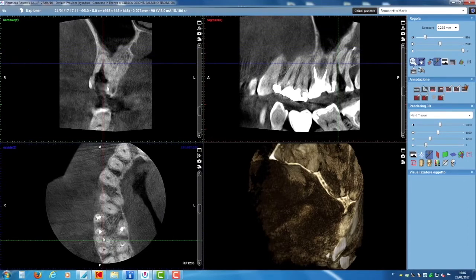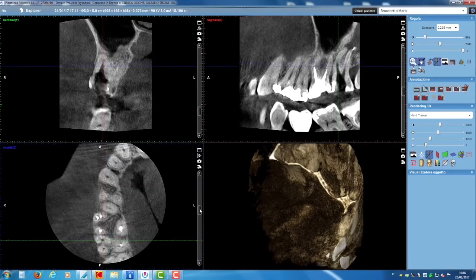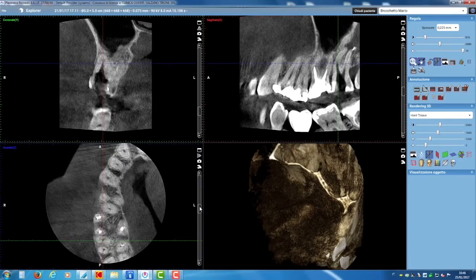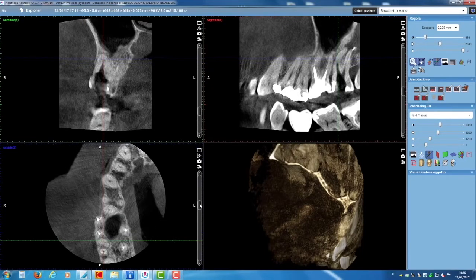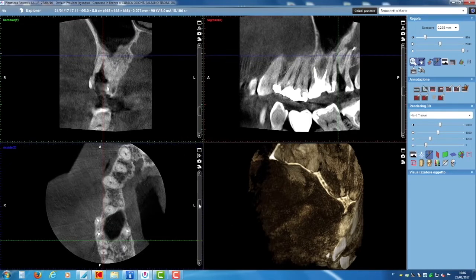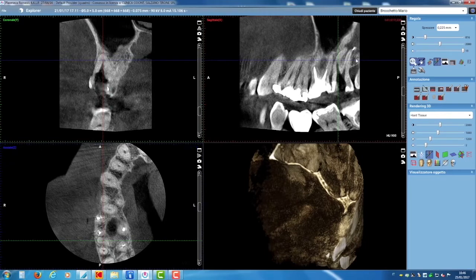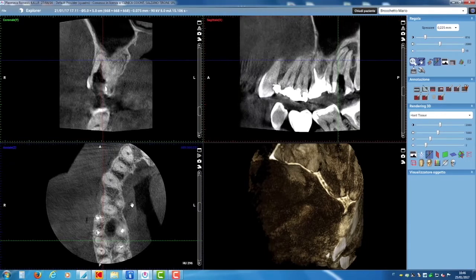Back to the wrong path I took — I measured and said to myself: I went up to this point, and now it's a question of understanding which direction I have to take to go in search of the canal visible on the CBCT image. As the cone beam resolution is 75 microns, the canal is not even small, therefore I'm sure that when I find it the file will easily reach the apex.